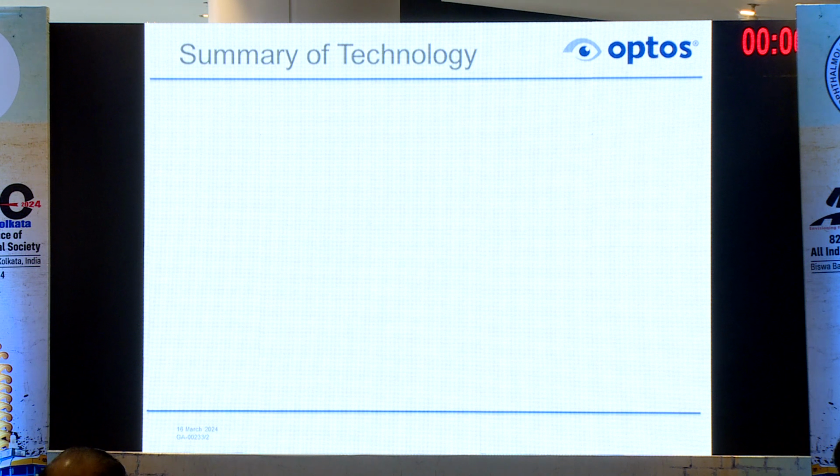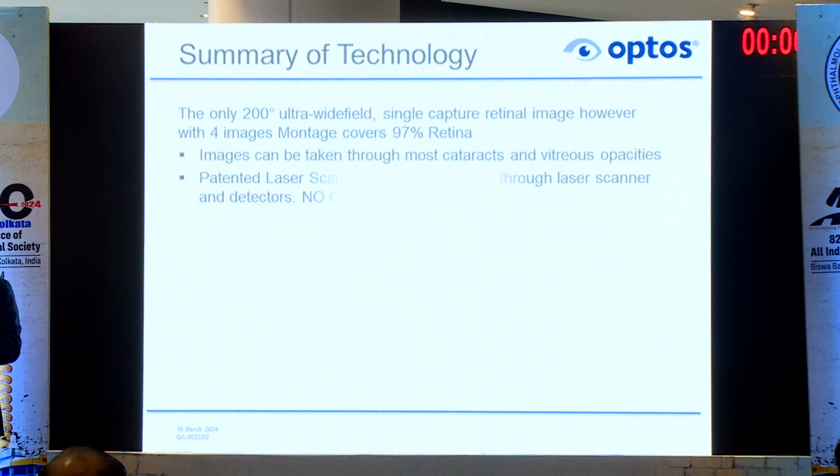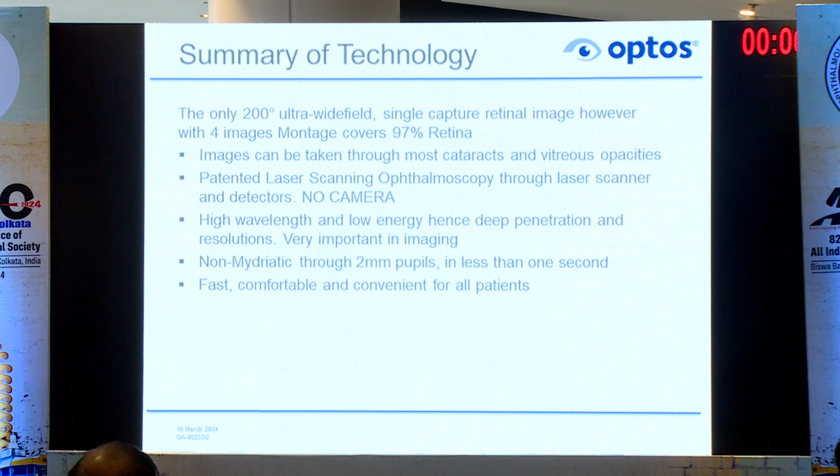So Optos gives a wide field, 200 degrees in one shot.